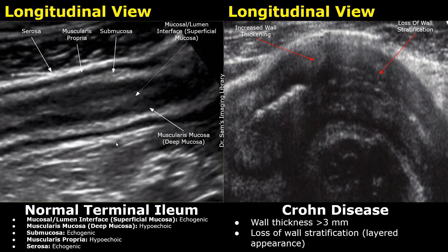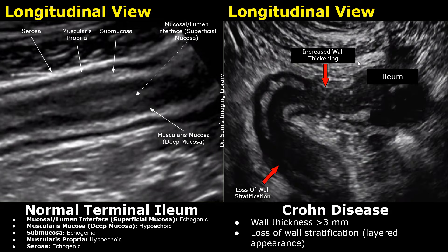Here is another case of Crohn's disease. We can see a thickened wall and there is loss of wall stratification — we do not see the layered appearance of the bowel wall. In this image, you can see increased wall thickening along with loss of wall stratification, and also prominent hyperechoic creeping fat surrounding the bowel loop.